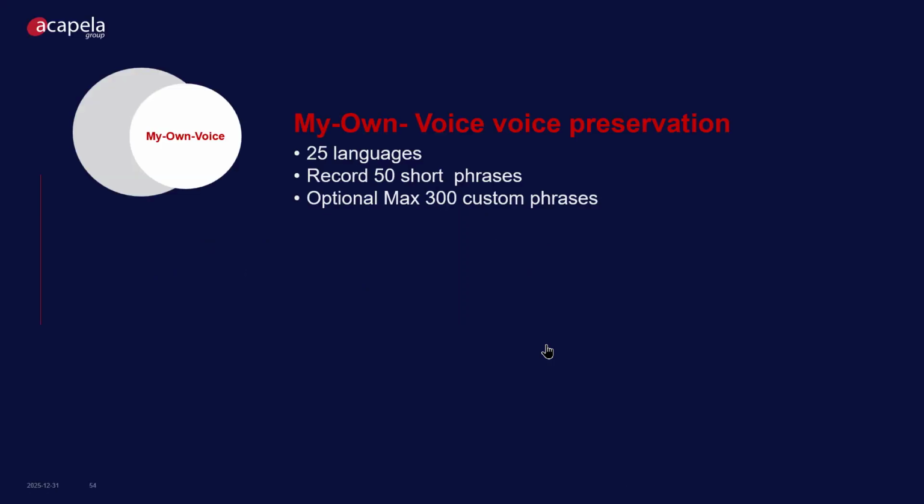So My Own Voice is a form of voice preservation or voice banking that's available in 25 languages and can be created with the speaking of just 50 short phrases. It takes literally 10 minutes to create your voice.